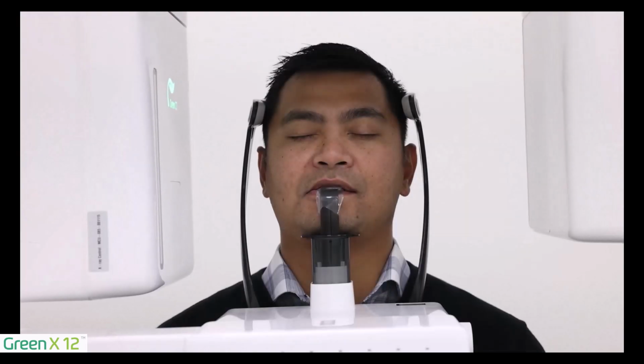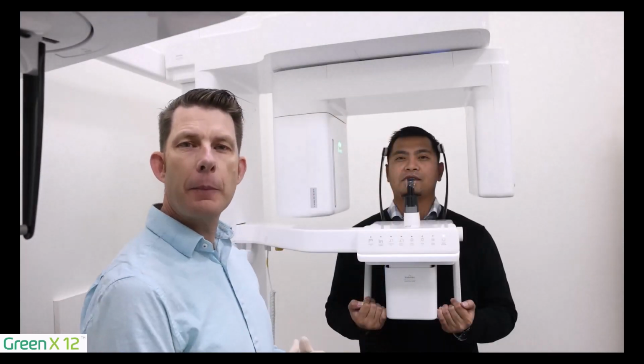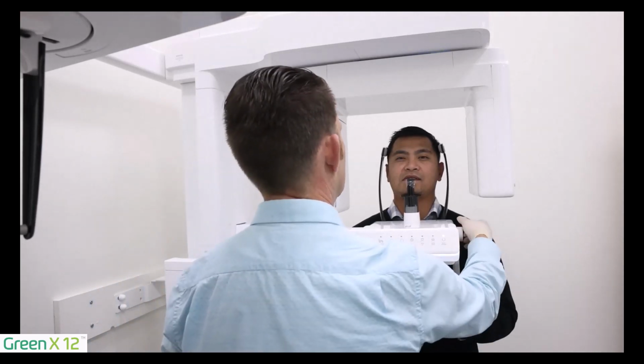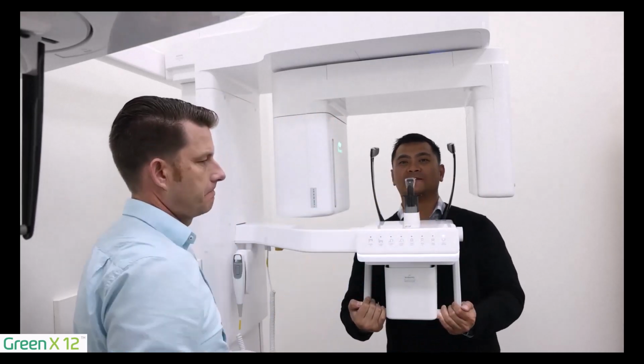Image capturing is complete. Please wait a moment. The scan is now complete. I'm going to go ahead and release the patient from the machine. And you can go ahead and take a step back and out of the machine.